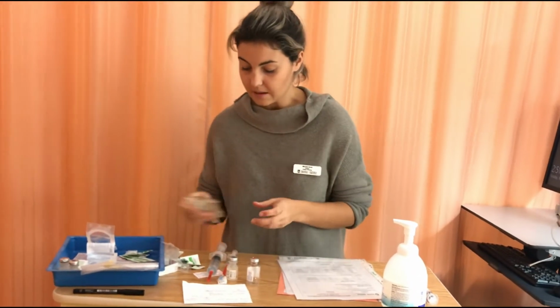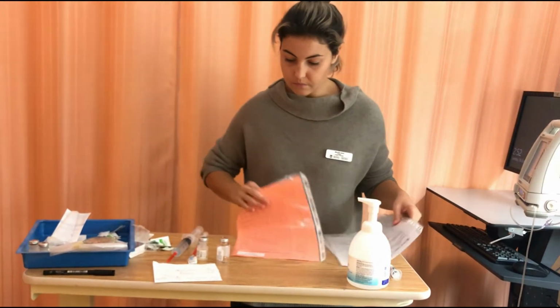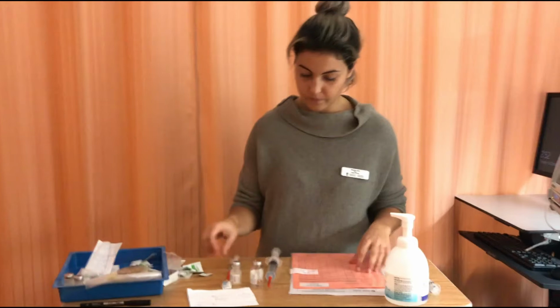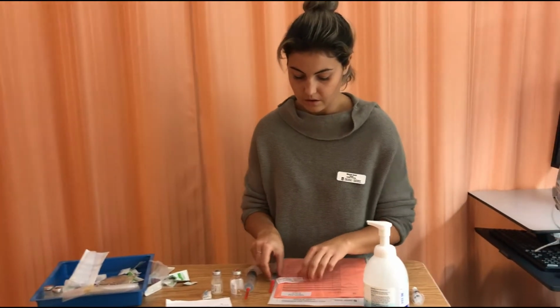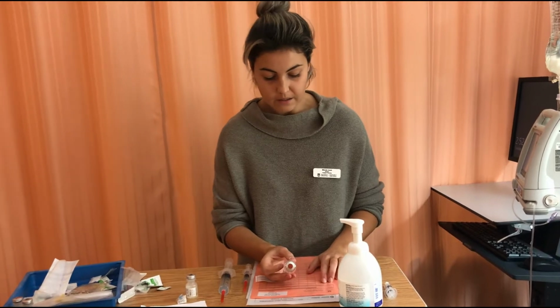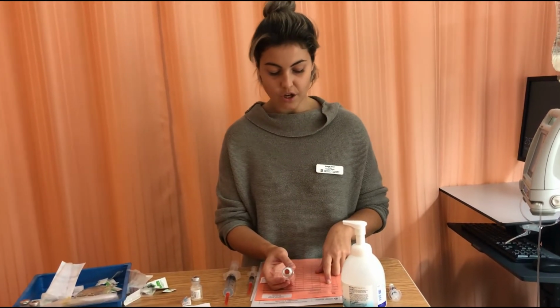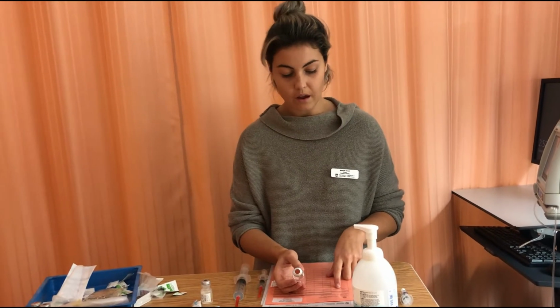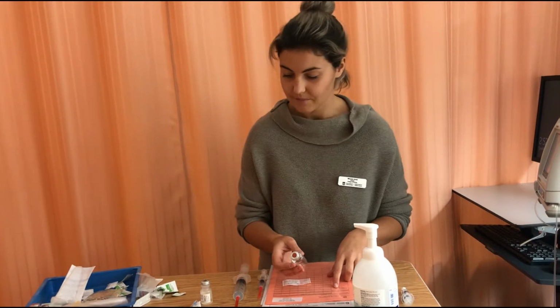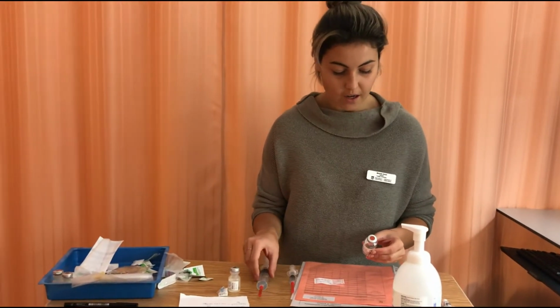Now I'll be doing my second med check. You might get stomach pain and diarrhea, so just let me know if that happens. I'll do my third check. Right patient, right drug, penicillin G, right dose: 3 million units, which equals 3 milliliters, which is what I have here in my syringe.